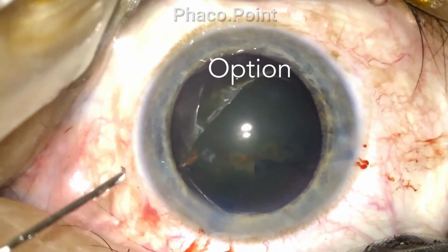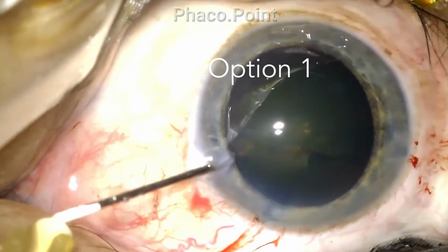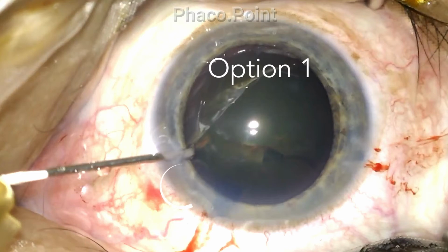I now attempt to introduce the cystotome through the left side port because now I have a flap that is raised and folded over, and I believe that with the cystotome now introduced through the left side port, I am going to be able to hold on to that folded part of the tear and propagate the capsulorrhexis further.